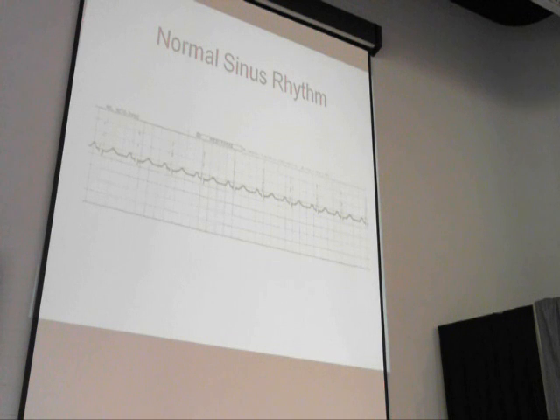You want to look at those before we give our rhythm a name. Just give them a name. And especially when we talk about the blocks later today, and in Mr. Rogers' world of cardiology, like we just said, there's one P for the QRS. When we start looking at some of the atrial dysrhythmias and ventricular dysrhythmias, there may be multiple P waves for the QRS, which you need to count.